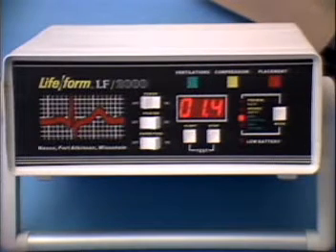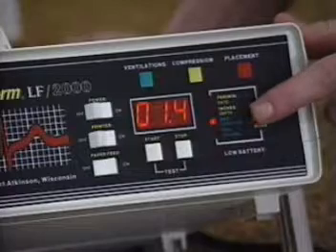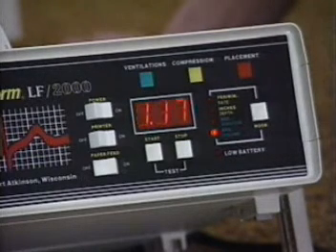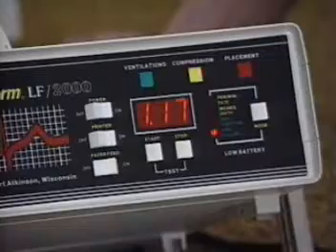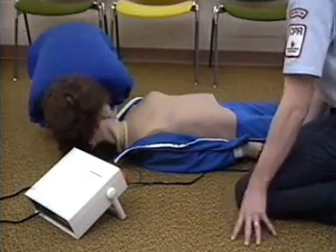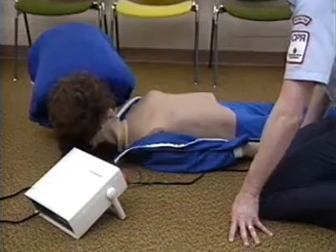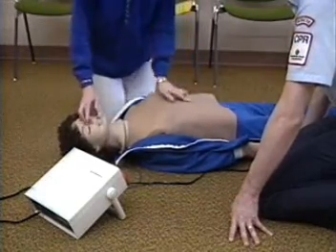To measure the exact number of cubic centimeters ventilated into the lungs, press the volume mode indicator on the electronic monitor. The student and instructor can isolate areas for improvement. Practice and more practice with accurate feedback will guide students into acceptable levels.